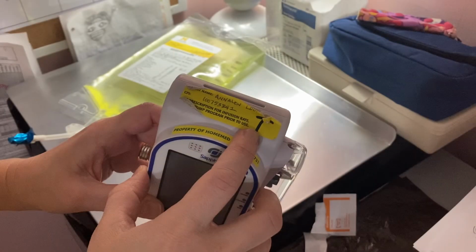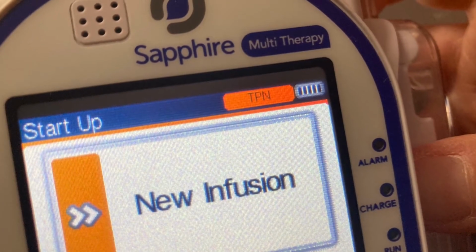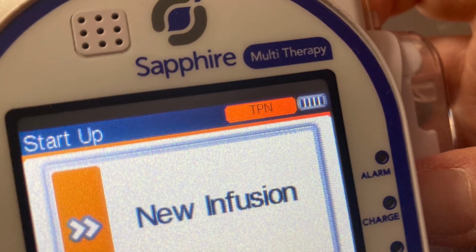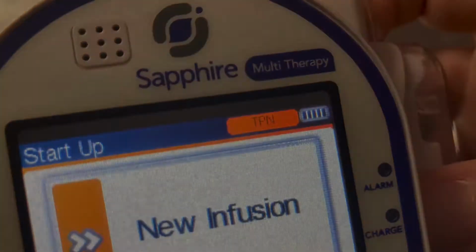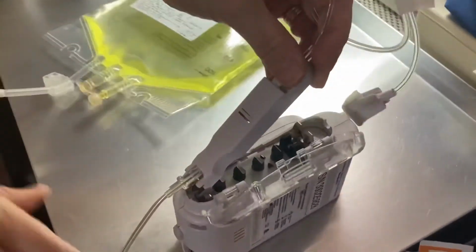Grab the TPN pump, which has a T on the top. You will see this pump has an orange label in the right-hand corner that says TPN to make sure you're using the right pump. Using the clear filter set, you'll do the same process to spike this bag.